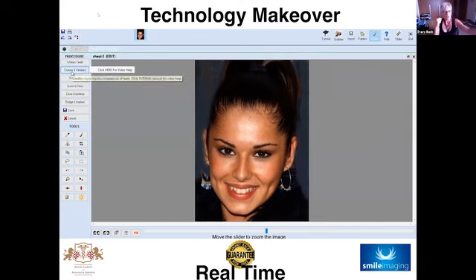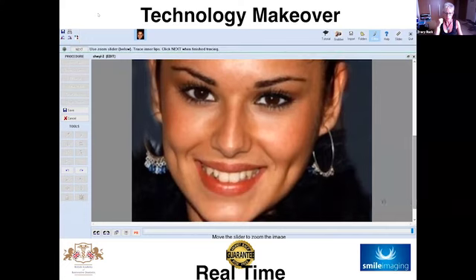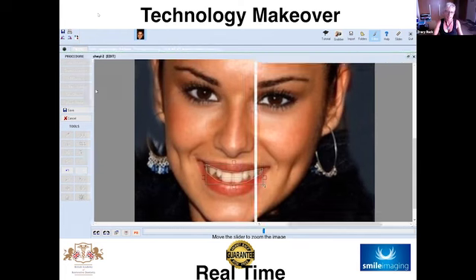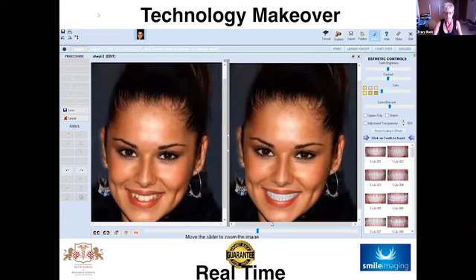So on the top left-hand side, you can see crowns and veneers, which we've clicked on. We've zoomed the photo in, and now I'm left-clicking and releasing around the patient's smile. If you was just going to do, say, the front centrals, you just go around the front 2 teeth. But obviously, in this case, it's a makeover, so around the whole lip line. We'll zoom it in again so we can see it a little bit more clearly. And then we can click on the various teeth within the library there. So you can get the shape of tooth that the patient would like.